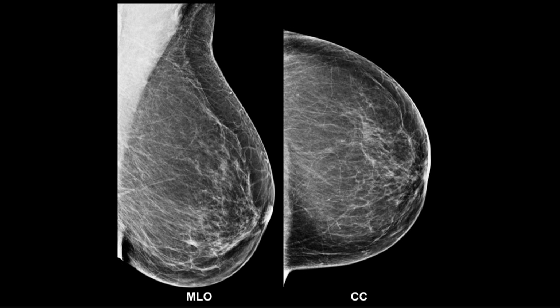But the two-step process that does work is if it's not too deep, so that it's definitely included on the view where you don't see it, and also that at that expected depth, there's just nothing that can explain that. Everything else spreads out. You don't need tomo. You can do it with 2D. And for the patients who you're screening, some may have tomo, some may not. For the ones that don't have tomo, you don't need to recall this patient if you are confident of the approach. You're not confident of the approach until you've tried it for a while.